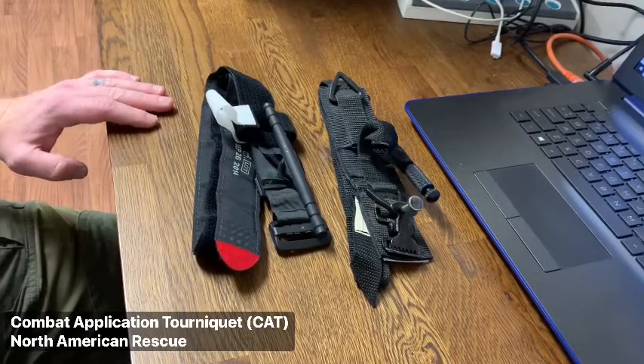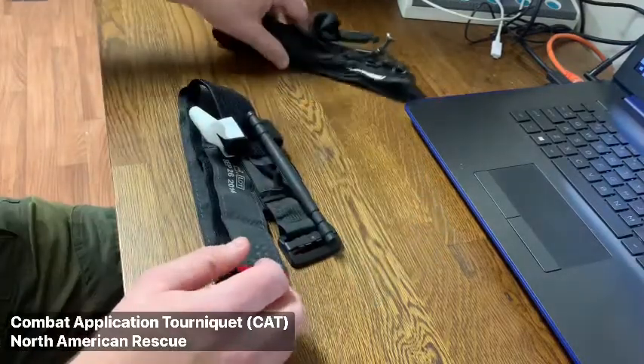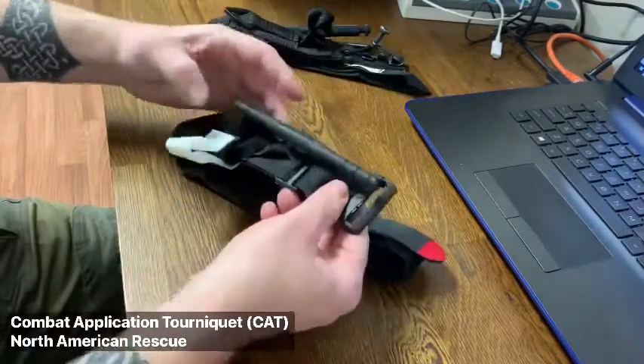Here are the two most common tourniquets that can be found among military, law enforcement, and emergency services. Both are effective as long as they are applied properly.